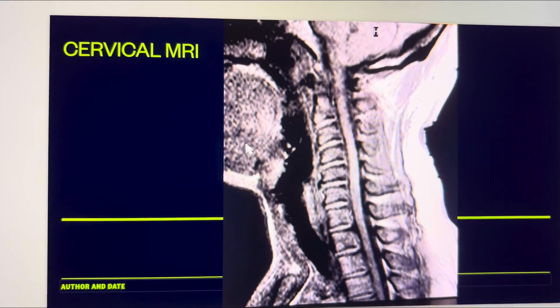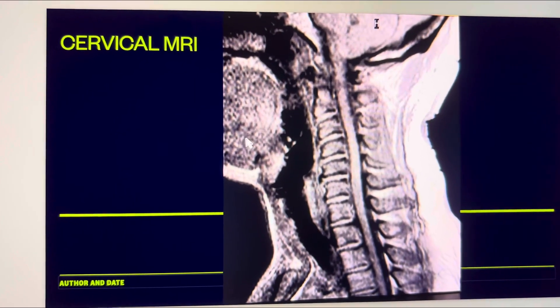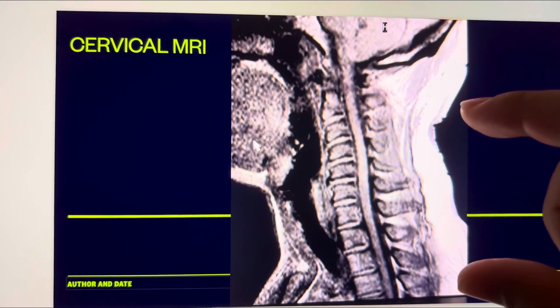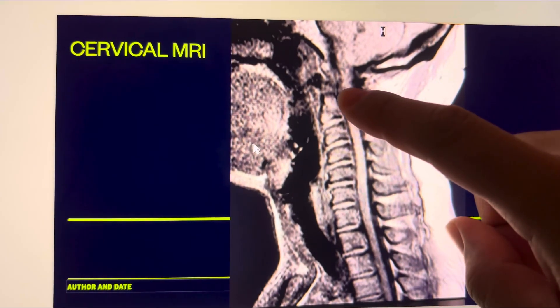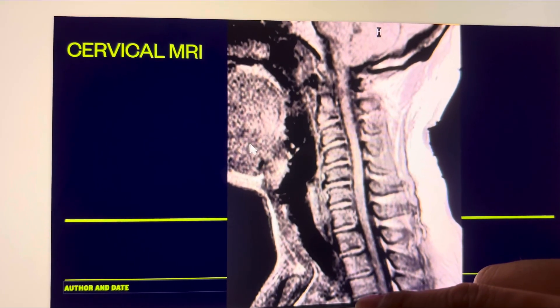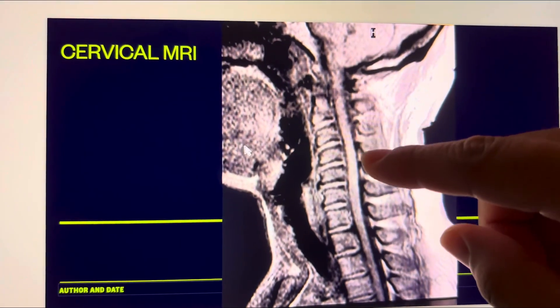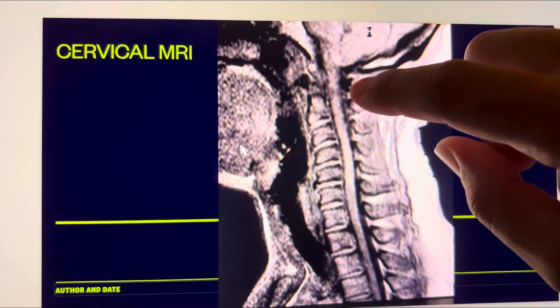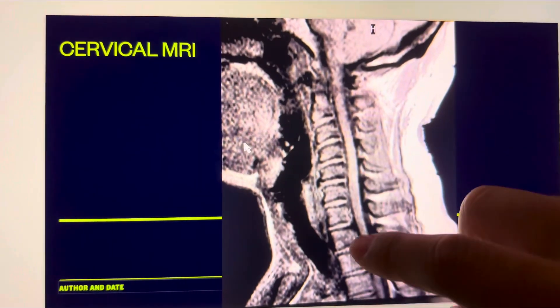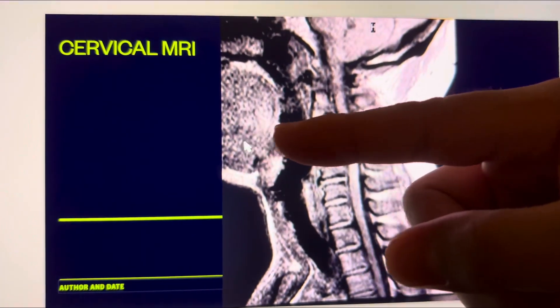Low quality again, but this is going to be the sagittal — the mid-sagittal, which is right in the middle of a person from right to left. We know that because we can see C2, cervical 2, 3, 4, 5, 6, 7, and then some of the thoracic ones. We see the spinous process of the cervical and we can see the spinal cord all throughout the spine — cervical and some of the thoracic. This is the patient's tongue, so the patient is facing that way.